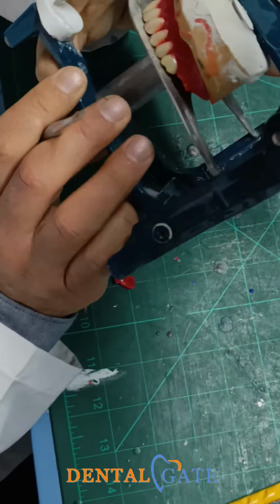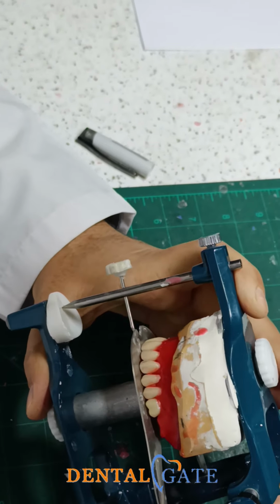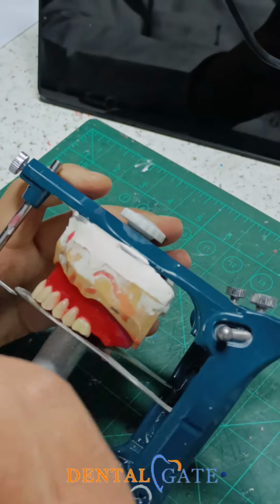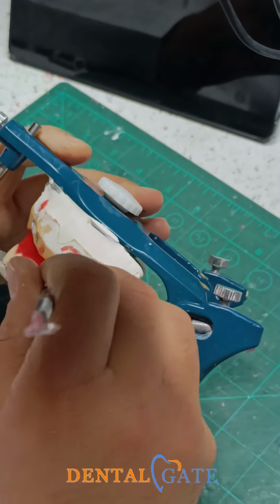Because the main objective of the complete denture or any full arch is the function. If you need to make aesthetic, make it with the implant for the anterior teeth, that's only. The main thing is to preserve the function, to preserve the normal position of the condyle.